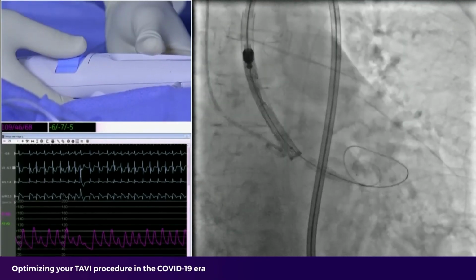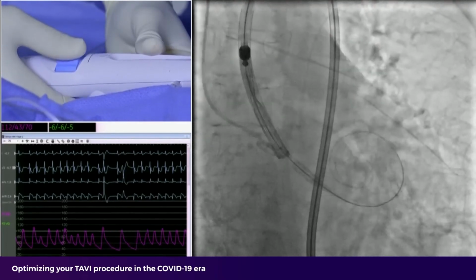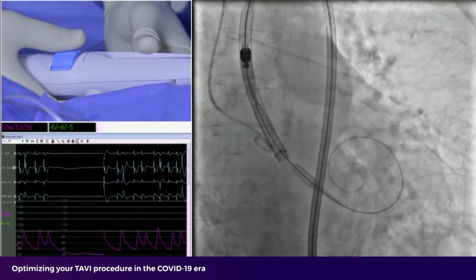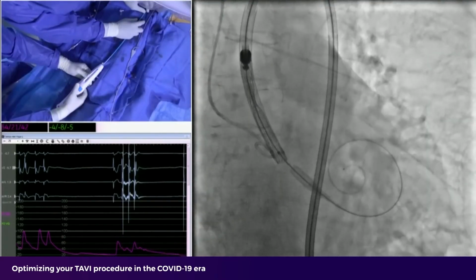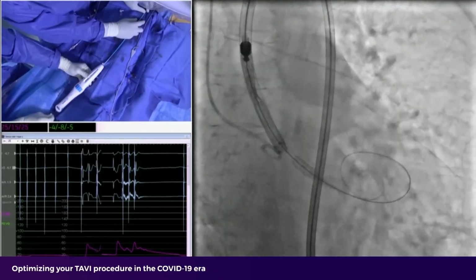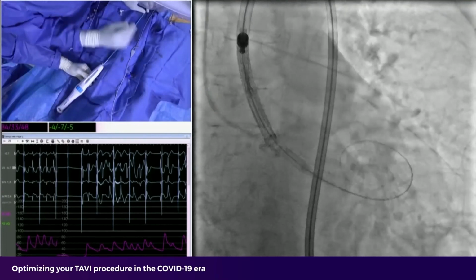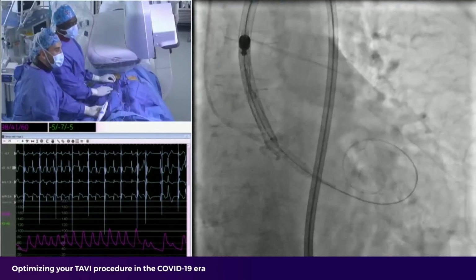So you saw that I was quite fast until we reach that point, and now the valve is going to flare, extruding from the catheter, and now I'm going really slowly to allow Didier. And a complete AV block. Yeah. You can simulate at 60. To allow Didier to fine-tune his position. Okay. Max, okay, thank you. Yeah. So we see that there was a complete AV block before anything. And you see that it's totally reversible because we went out, and it's totally reversible.